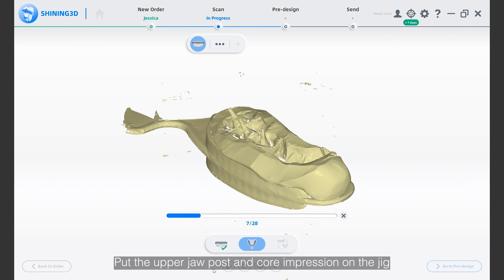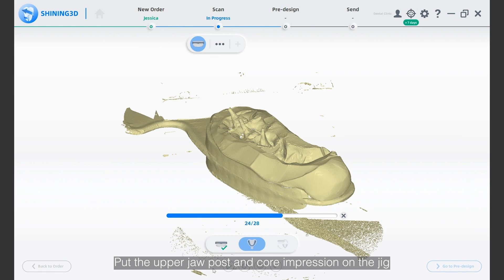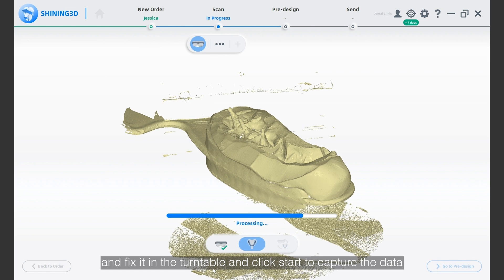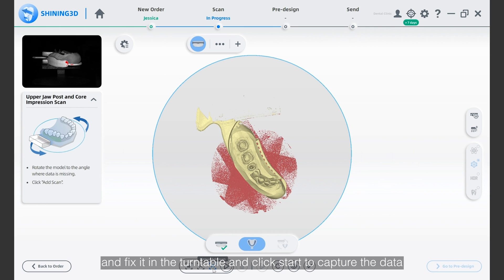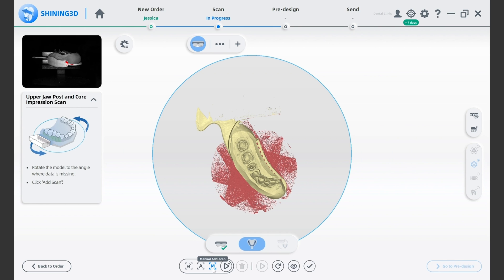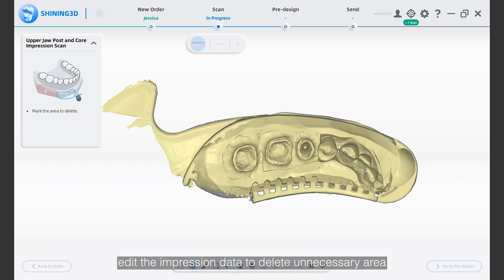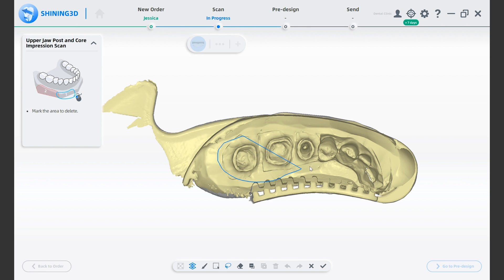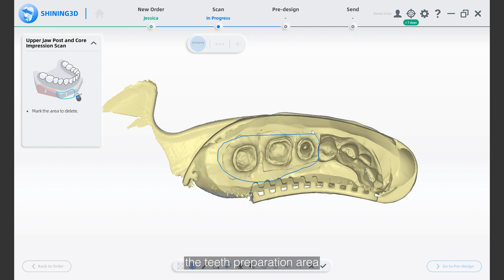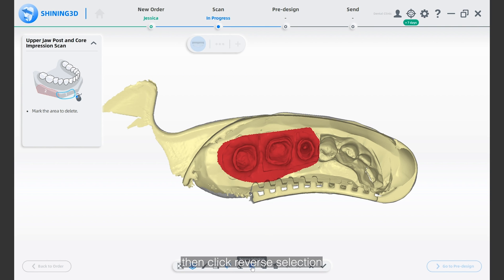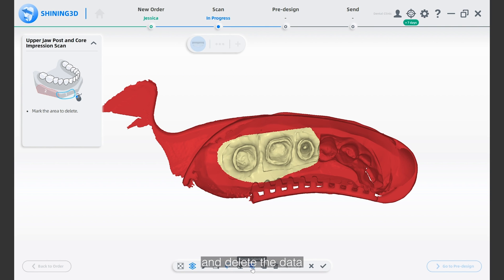Put the upper jaw post and core impression on the jig, fix it in the turntable, and click start to capture the data. After finishing the impression scan, edit the impression data to delete unnecessary areas. Choose the area you need — the teeth preparation area — then click reverse selection and delete the data.